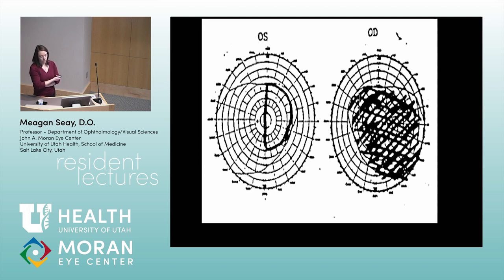a junctional scotoma. So a junctional scotoma causes a temporal defect in one eye and a central defect or diffuse optic neuropathy defect in the other eye. So that localizes to the chiasm, but it's involving more of the right optic nerve than the left. That's why you get so much involvement of the right optic nerve, and it extends back to the chiasm and affects those fibers that cross and causes that temporal defect on the left eye. So this localizes to the optic chiasm, a little bit more anterior in the right optic nerve, though. So you think of things like pituitary tumors, any optic chiasm lesion.